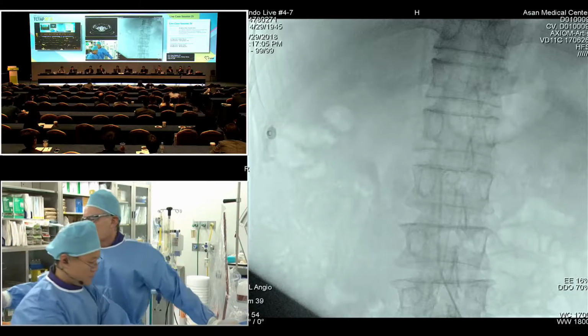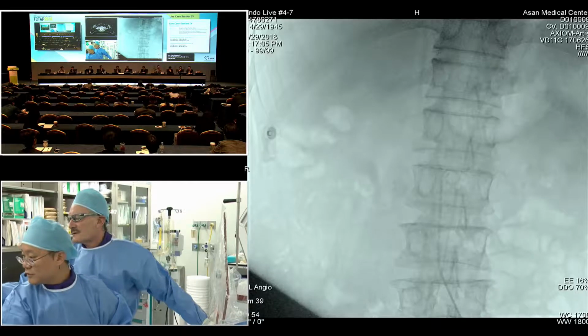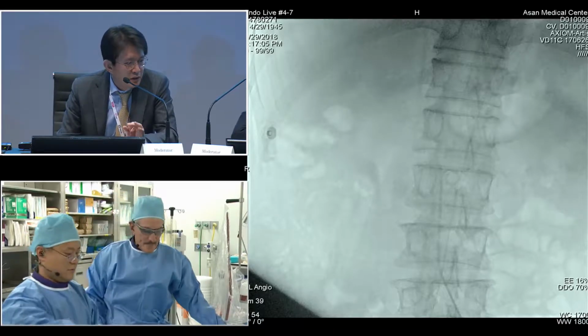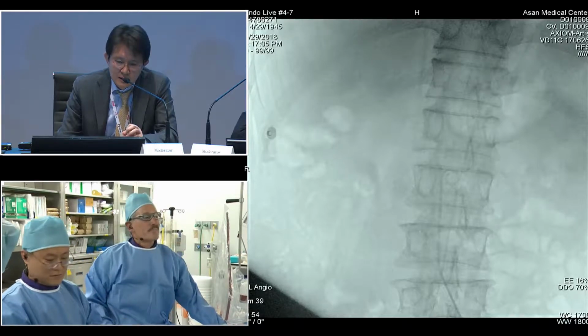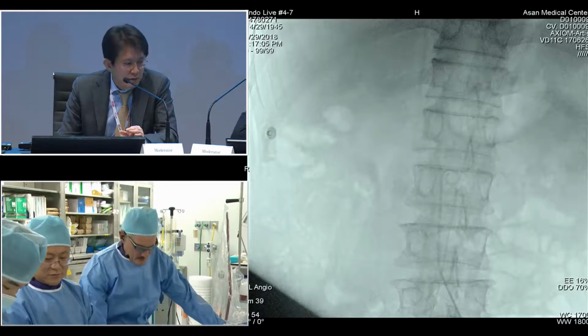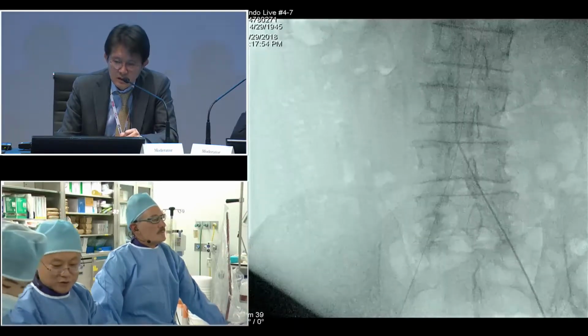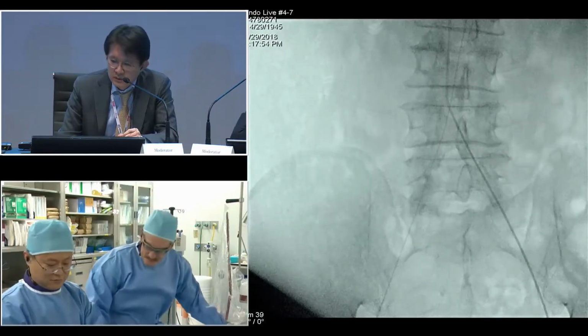Also, in the heavily calcified region, CT scan overestimated the vessel size, so we cannot clearly find which vessel size is correct by the CT scan. So I think IVUS is very helpful. It's my gut feeling.